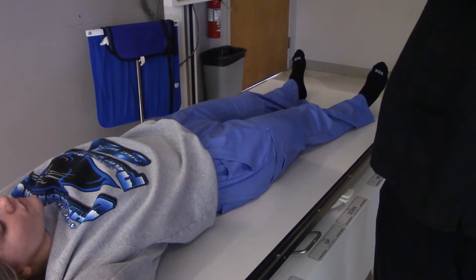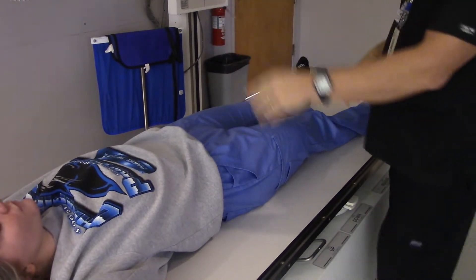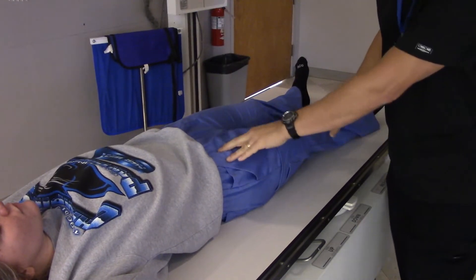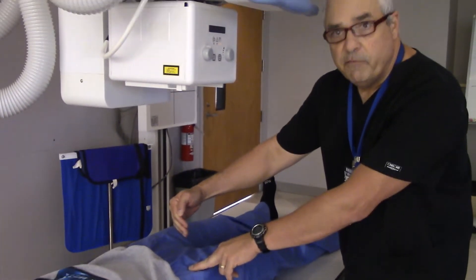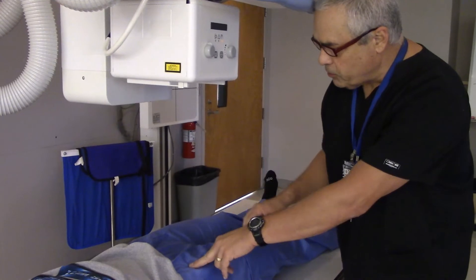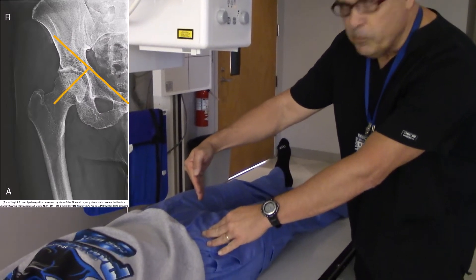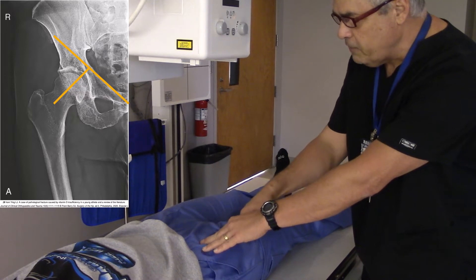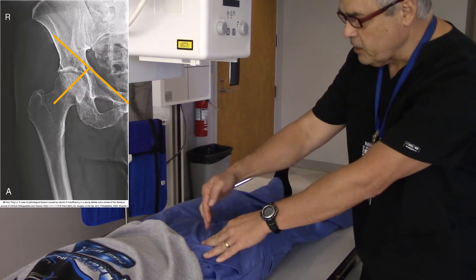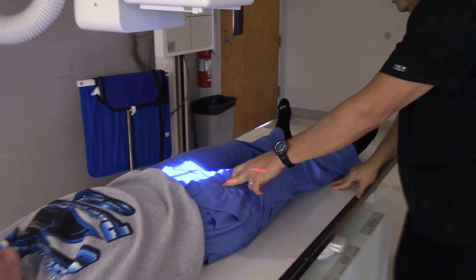I'm going to bring the tube down to a 40-inch SID, roughly. Now, where do I position my patient? What I've got to do is locate the patient's ASIS, which is right here, and then the patient's pubic symphysis, right about there. I'm going to draw an imaginary line between the symphysis and the ASIS, and then come down about two and a half inches from that — right about here is going to be my aiming point.